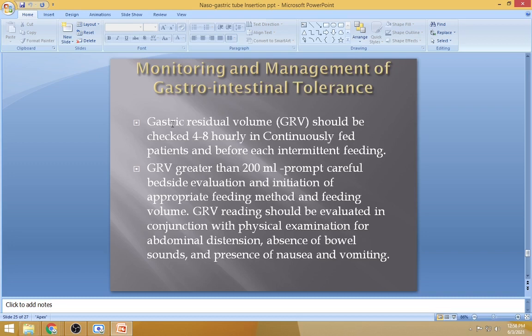Okay, before feeding the patient, what do we need to do? Suppose you have inserted the NG tube, everything is ready, and now you are supposed to feed the patient. How are you supposed to feed the patient? Flush the feeding, yes. No, not flush. First of all, you have to see whether the tube is in the stomach or not, whichever way you do it. And if the aspirate comes out from the stomach, that means it is in the stomach. Yes or no? Yes, ma'am. So you aspirate and see.